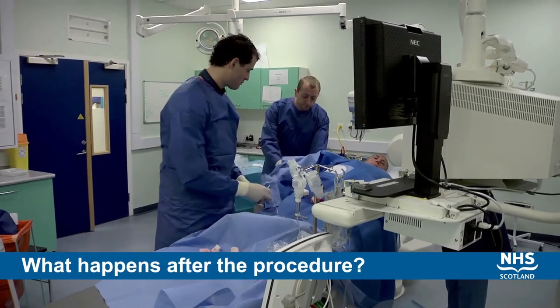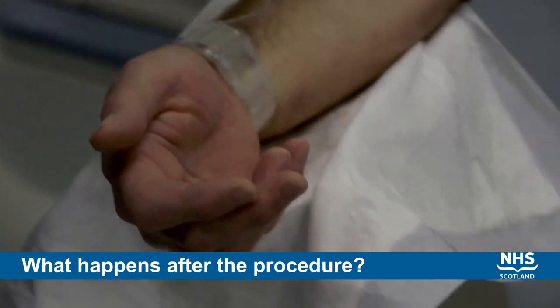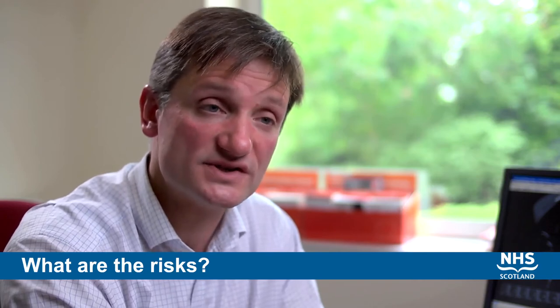After the procedure the catheters are removed and a pressure bandage is applied over the wrist or at the top of the leg, and you're taken back to the recovery ward for observation. It is not uncommon to have slight discomfort at the site where the catheter enters, either at the wrist or the top of the leg, and very commonly there's minor bruising. Sometimes the bruising can be more severe, and this is why patients are observed after the procedure on the recovery ward to monitor for this.